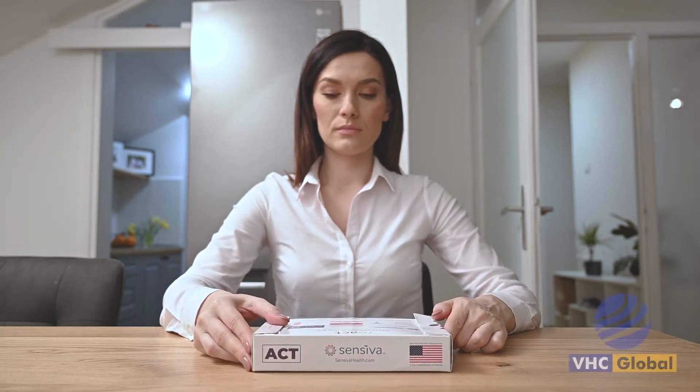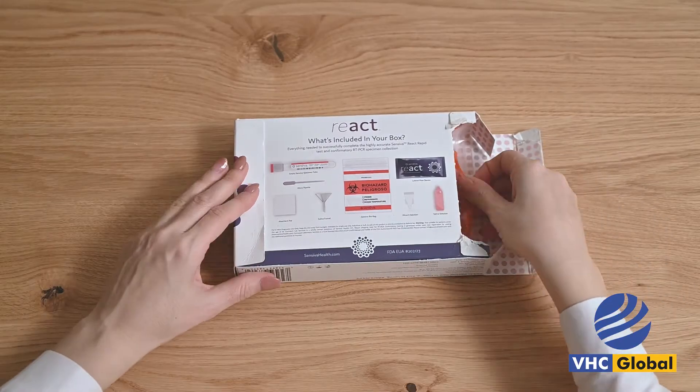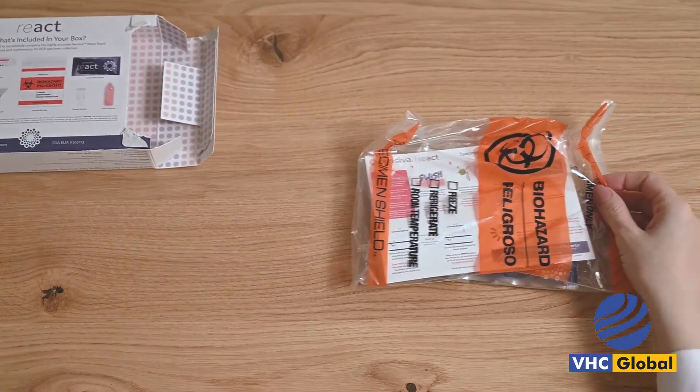Vanin Healthcare Global presents our new fast test for COVID-19. Find out if you are COVID-19 positive in just a few simple steps.